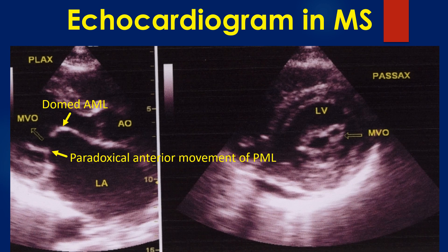The left panel shows the parasternal short axis view. The mitral orifice is seen within the cross section of the left ventricle. The anterior and posterior leaflets are seen in cross section and are thickened. The commissures are fused.